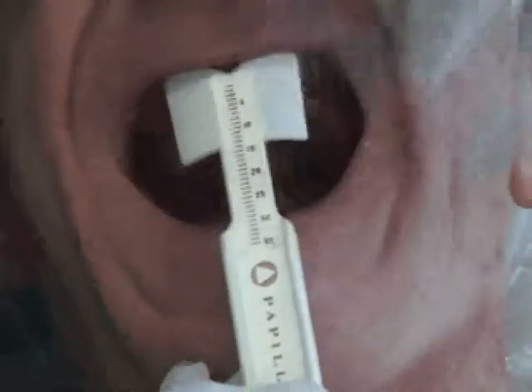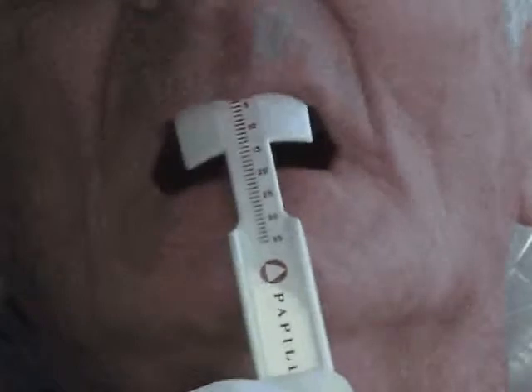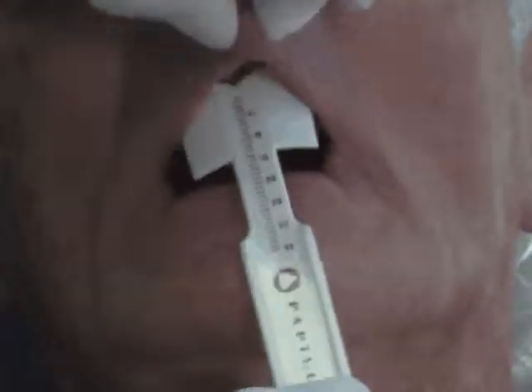That fits onto the ridge, just relax your jaw and just relax your lip. We just pull the lip up, just deadpan drop it onto that. Don't pull it, just let it drop.